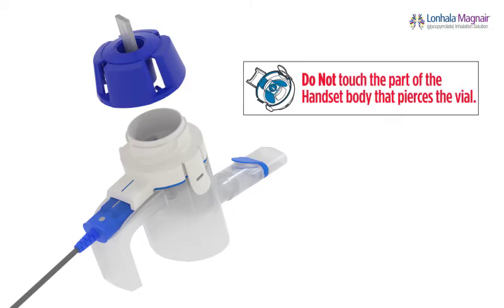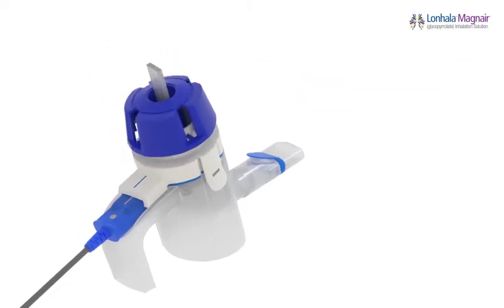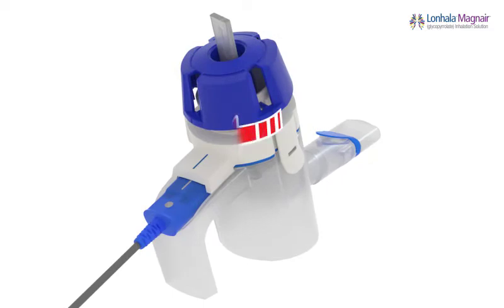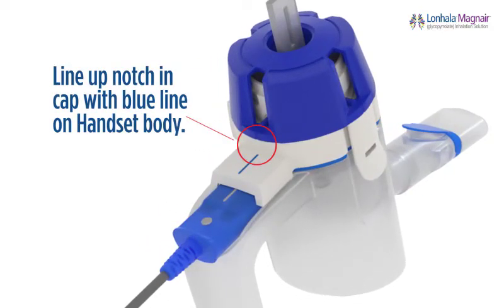Prepare to attach the medication cap. Do not touch the part of the handset body that pierces the vial. Place the medication cap with the Lanhala vial on top of the handset body, then turn the medication cap in a clockwise direction. As you turn the medication cap, the Lanhala vial will open and you may hear a click. The notch, which is at the base of the opening in the medication cap, should line up with the blue line on the handset body. Do not remove the medication cap or unclasp the handset body until the treatment is complete, because your medicine could leak and you will not get your full treatment.